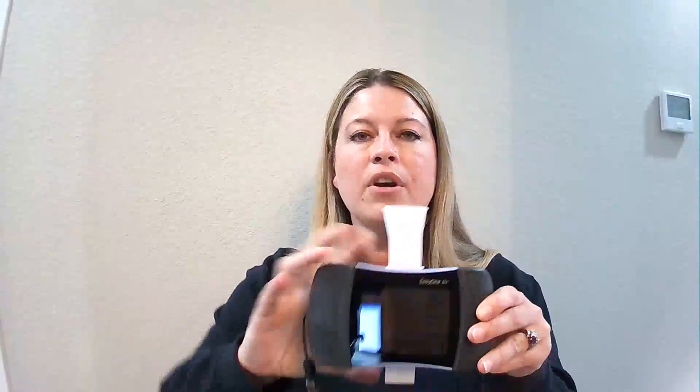First, remove both the flow tube mouthpiece and the Filter FT from their packaging. Insert the flow tube into the handheld spirometer just as you normally would.